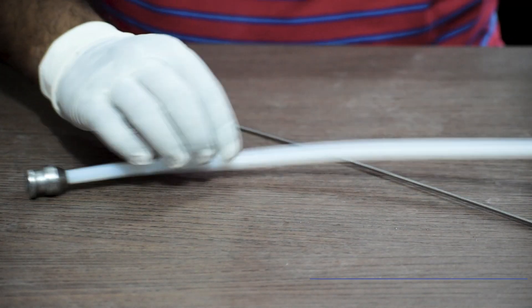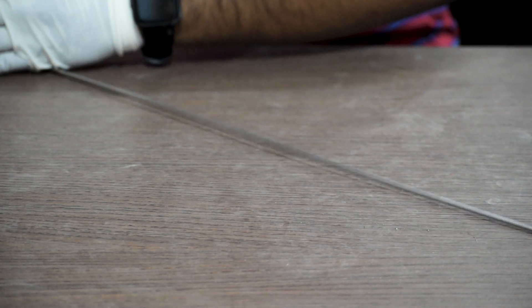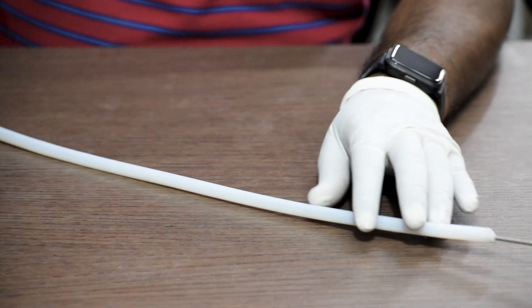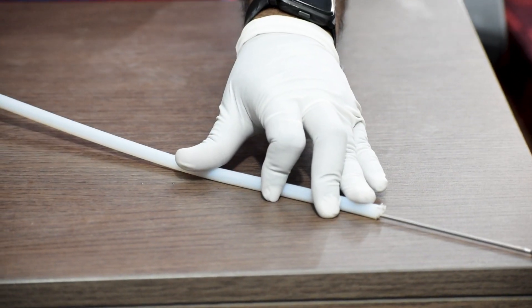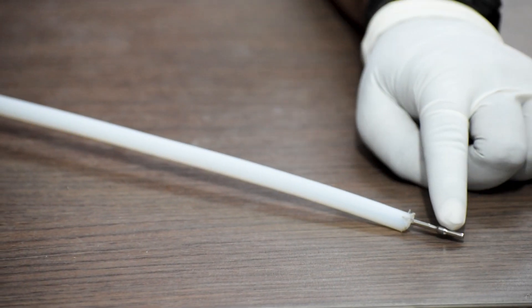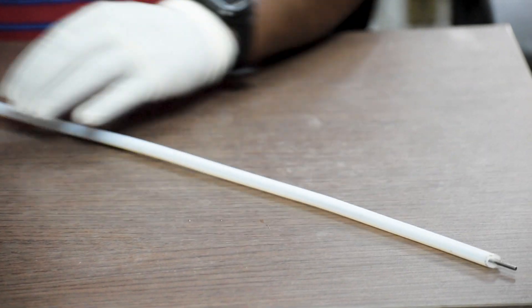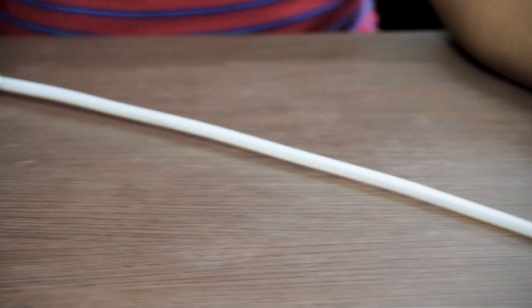Thereafter, we will use the medullary tube, inserting it through the help of the guide wire. Once inserted, we will check under the C-arm that the medullary tube is properly inserted and the end of the guide wire is in the proper place — confirming the medullary tube has gone all the way to the beaded end of the guide wire. Once done, we remove the beaded or olive guide wire and insert a plain guide wire through the medullary tube.